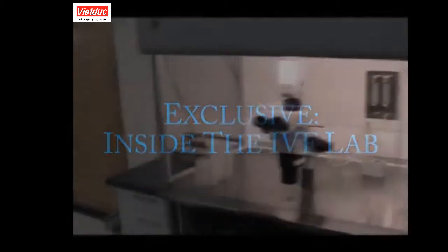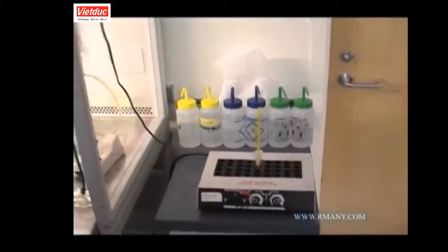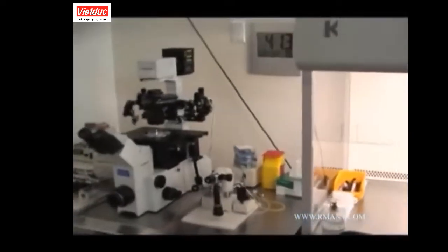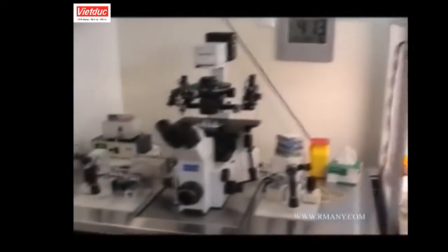This video will give you a brief tour of our laboratory and an introduction to some of the procedures performed for your IVF cycle. We'll show you an egg retrieval, an insemination and evaluation of egg fertilization, daily assessments of embryo development, and the embryo transfer procedure. We will also show you some special procedures, including intracytoplasmic sperm injection, assisted hatching, and embryo freezing.